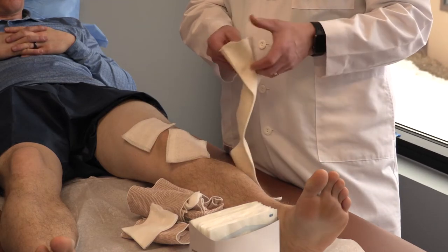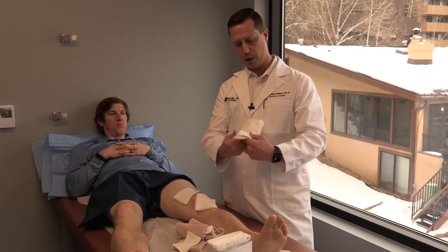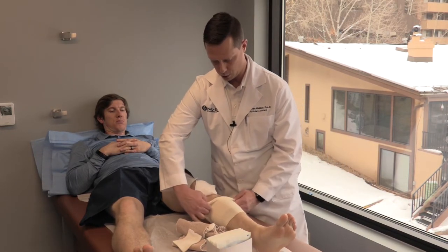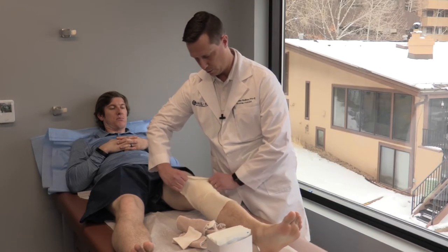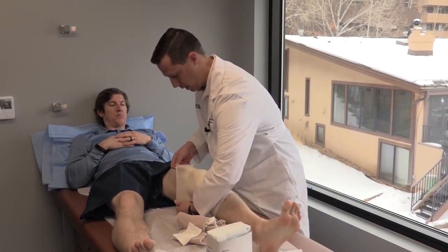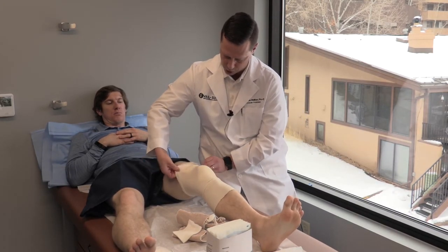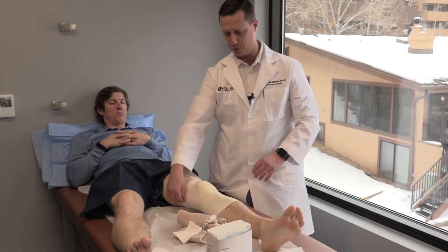I like to kind of fold it in on itself like this, and then it makes it a little easier to unfold. Once you pull that up, you go straight over the foot and come all the way up to the dressing, and then you can unfold it over the rest. Just pack that in as best you can — you want to get it nice and flat so that it's comfortable. But there's no big trick to it; whatever feels good is fine. It's just to keep everything covered for those first two weeks.